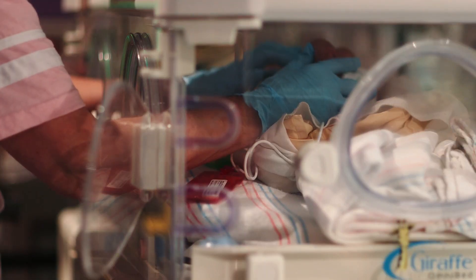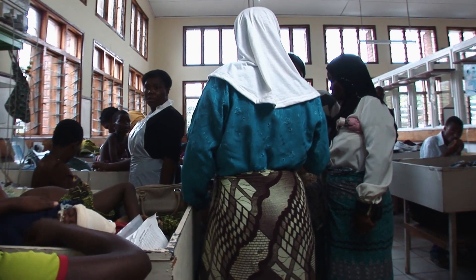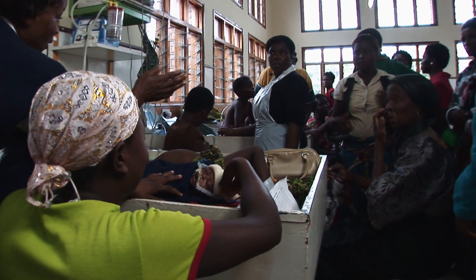A large percentage of neonates die from hypothermia all across developing countries. There are current products on the market in the US and other developed countries that help deal with this problem. However, they are far too expensive for developing countries and have far too many components that can break and are too complex for the issue.